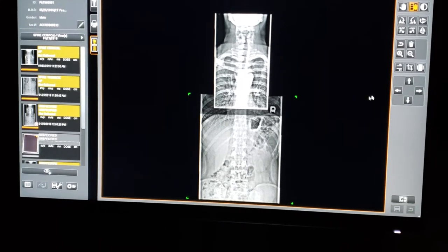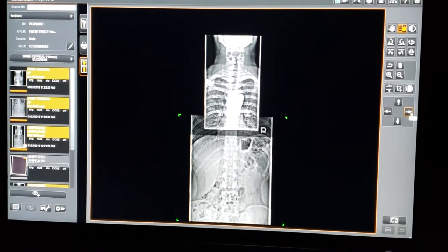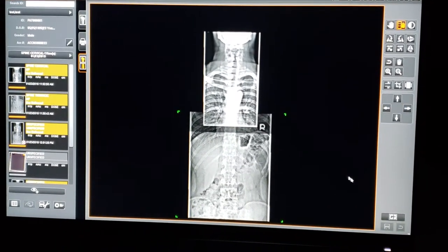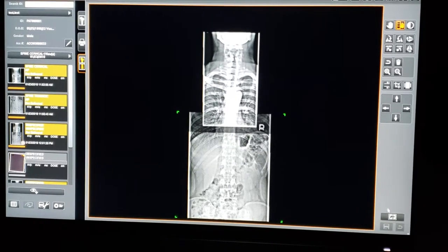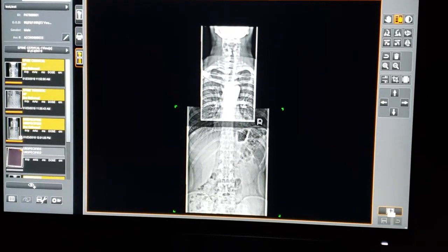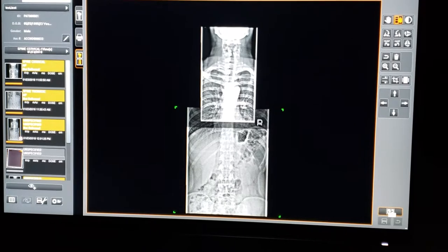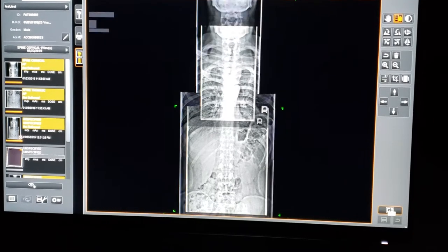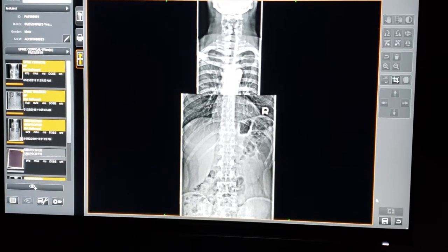You can still adjust using the up and down and left and right arrows at this point. Now, down in the bottom right, all you're going to do is click on the paste button, and there's your full spine image.